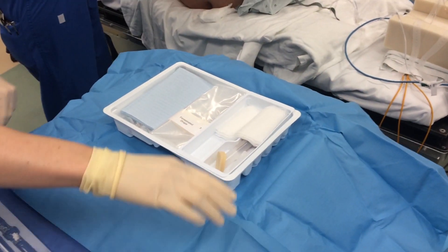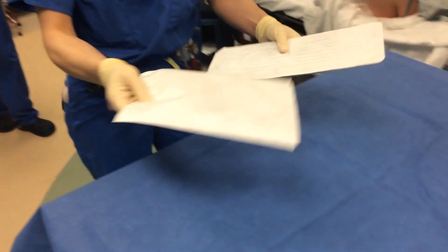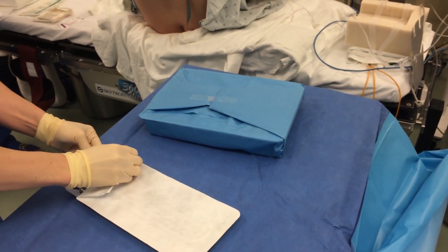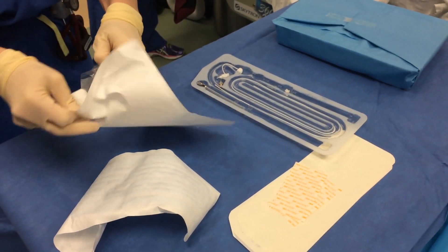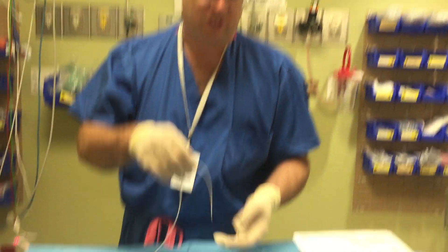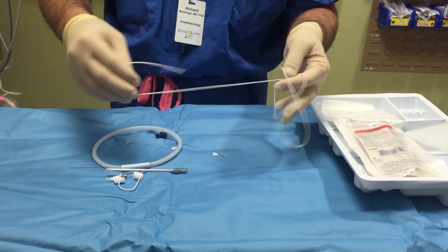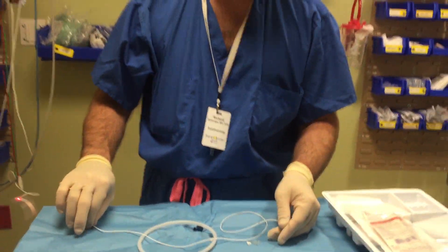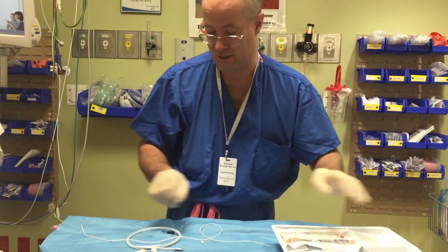Then we open the catheter itself. Here's an inner sterile peel pack which contains two items, and then there's a separate peel pack with a long thin stylet wire for the catheter. The catheter itself is very thin and flexible, much more so than an epidural catheter. It can be inserted into the patient either unstyletted or styletted. I prefer to stylet it myself, but either technique is acceptable.